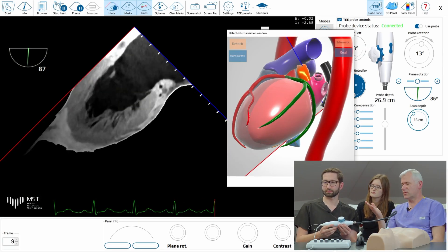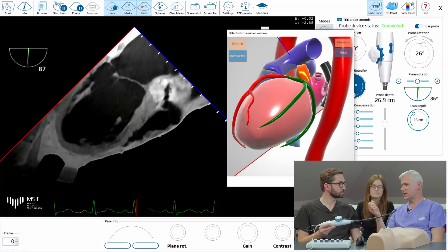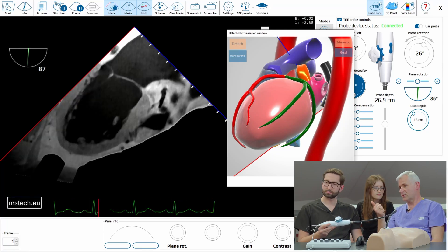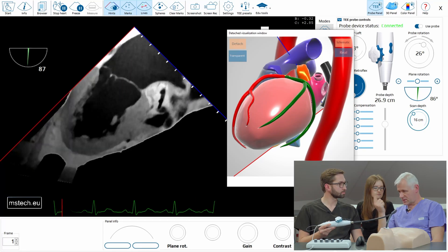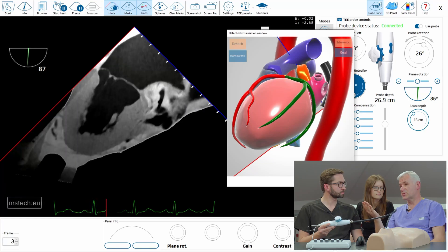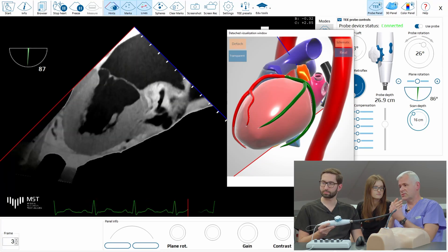We did so many views now because we did the upper esophageal views, we did aortic valve, we did inflow-outflow, bicaval, all the mitral — the most important mitral views — and then left atrial appendage views.